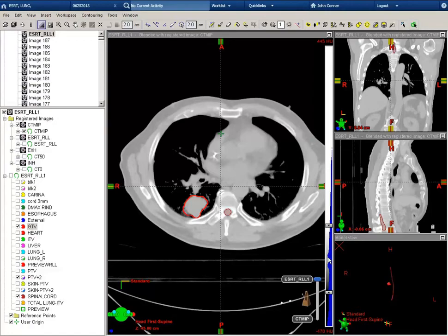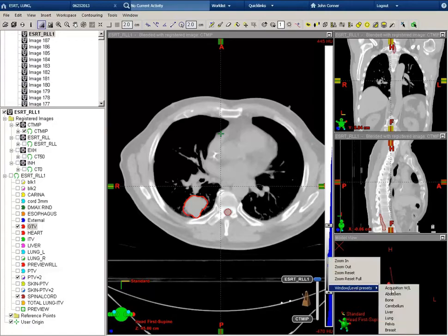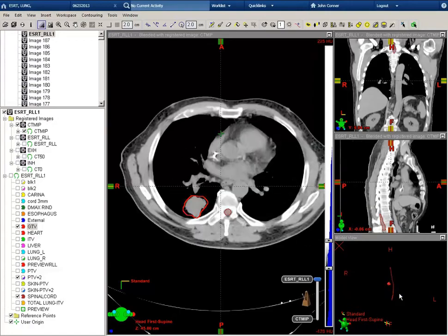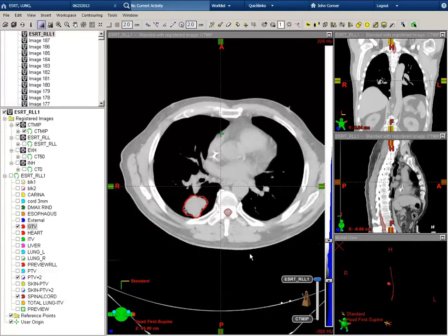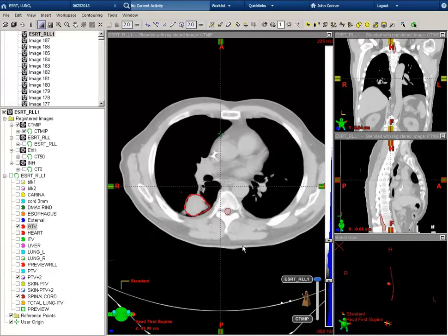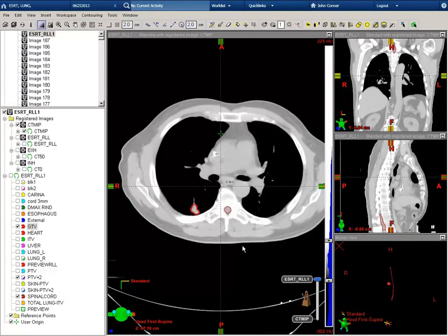Let's look at the contours that are necessary for an ESRT lung patient. First, I'll adjust the window level and select the auto-default of abdomen and make some small changes to the window level.